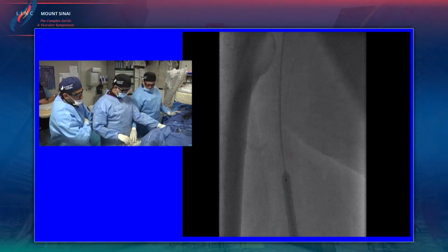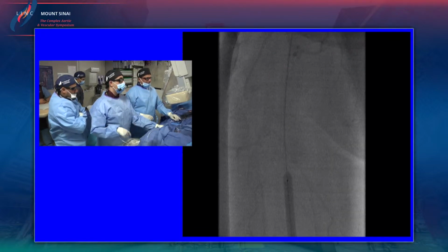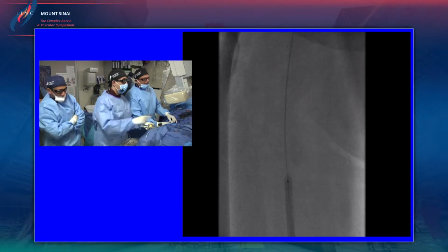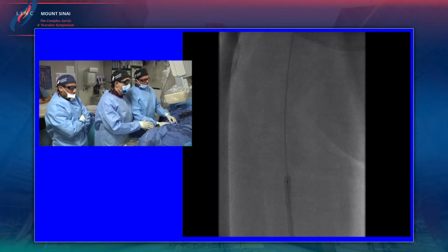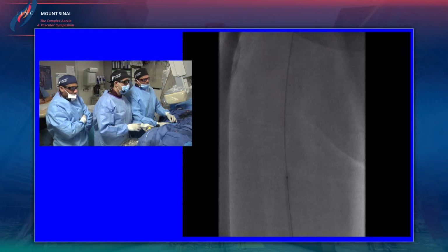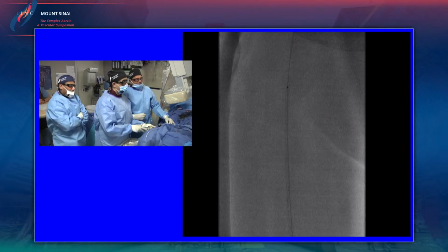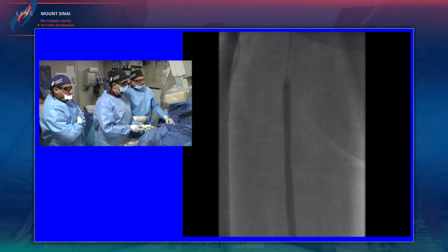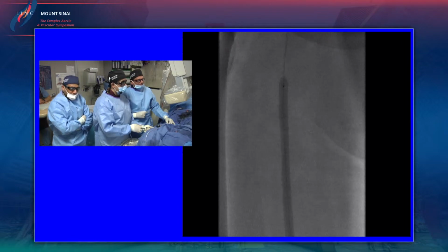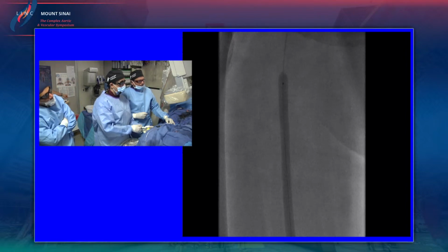Prakash, this is Jose, did you consider a pulse spray that we've used in the past? We thought about it, Jose, because we weren't expecting this to be completely occluded down, meaning thrombotic. We were very surprised at what we had with the IVUS and the ease with which it crossed, as Dr. Bienvenido said. So I think at this stage we're dealing with a thrombotic lesion. We could have done a pulse spray, but let's see. We did the AngioJet to prevent it, and I hope we don't live to regret that. We'll see now. You can see this area is really atherosclerotic the way it's expanding. And I think the chocolate balloon is nice because it limits dissections. So let's see how this looks.